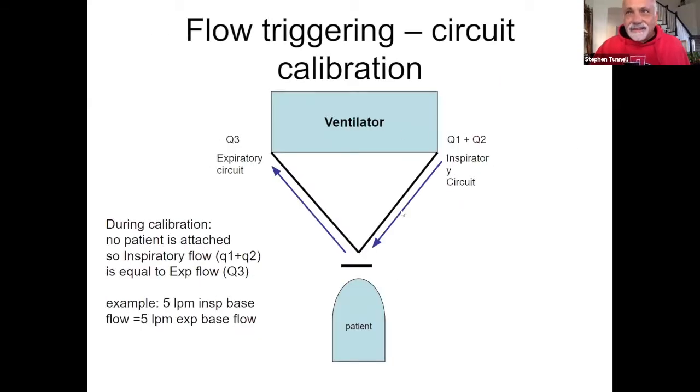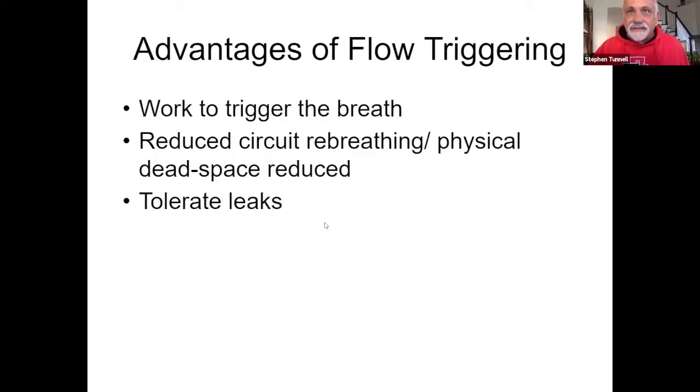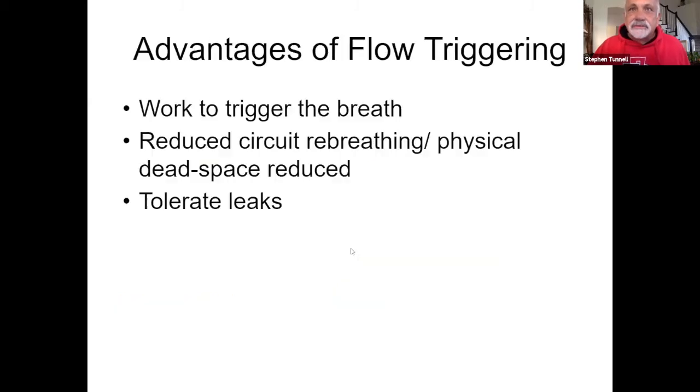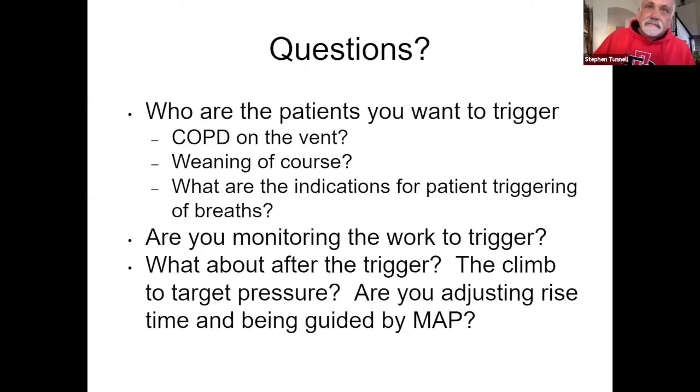Essentially, the gas is constantly flowing, so the dead space truly is the dead space past the patient Y and the endotracheal tube, and of course the anatomical dead space. And essentially with free flowing gas, Catherine Sassoon showed back in the 90s that the trigger time could potentially be reduced in a properly set ventilator.